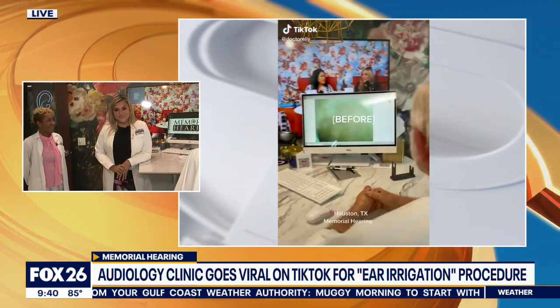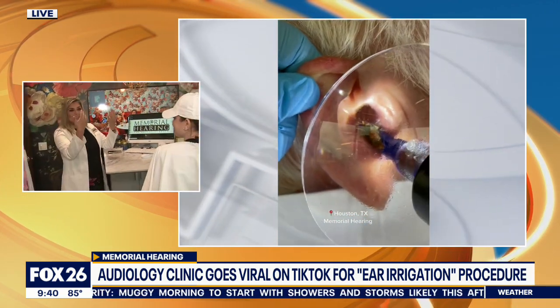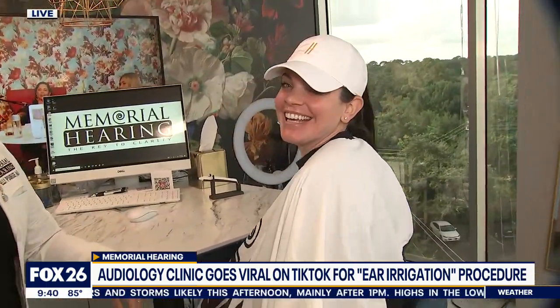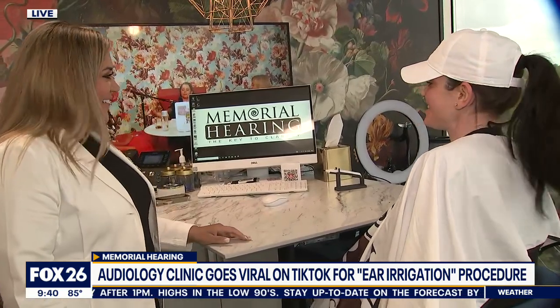Do you have a patient there who's going to undergo it? We do — we have a lovely model. Would you like to tell them your name? My name is Lauren. She's our model from next door, Dr. Hamlin's dentist office. So she's just modeling for us, but apparently she has some wax, so we're going to take a look. Well, she's a good sport — show us how it works.